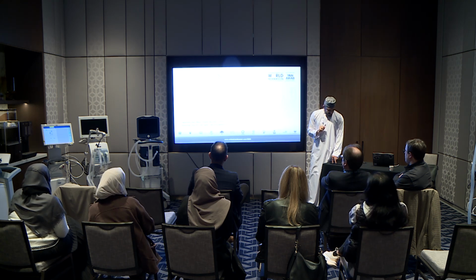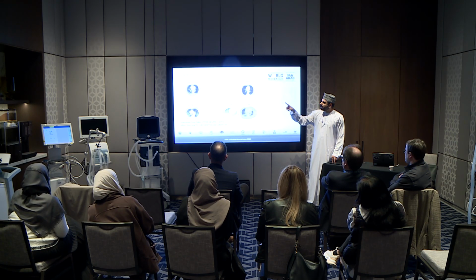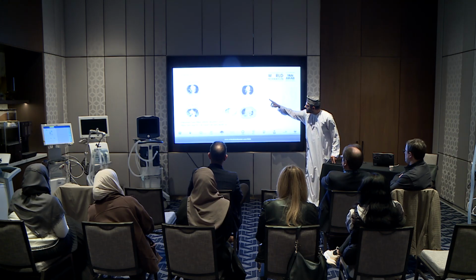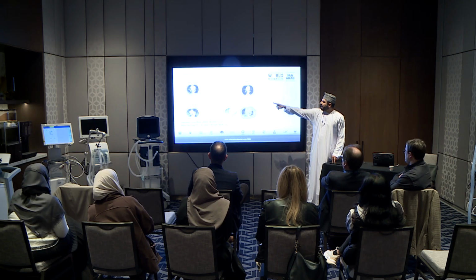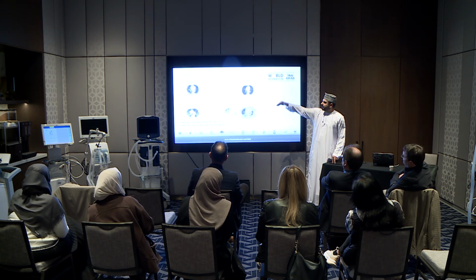So that's why it's very important to monitor the respiratory drive and the respiratory effort. This is just one of the examples. This is a COVID patient with an L-type kind of COVID. And this is the respiratory effort that the patient actually has, with a pleural pressure of, I think, near 11 centimeters of water. Throughout the days when the patient was followed, from 0 to like 15 days, there was no worsening in the patient's hypoxia or the features of ARDS.